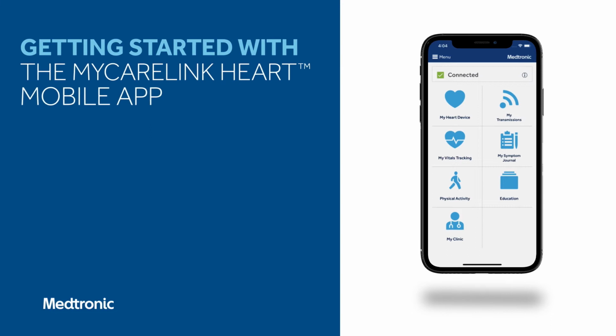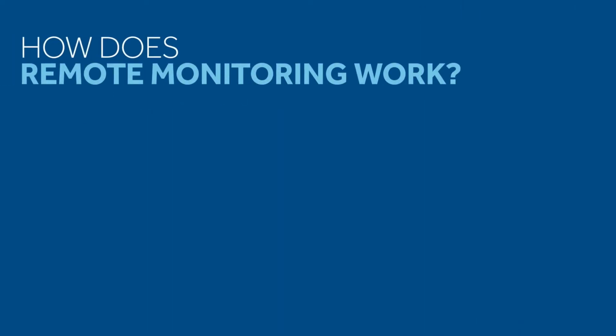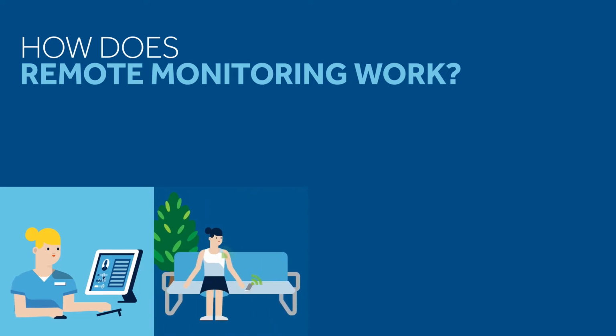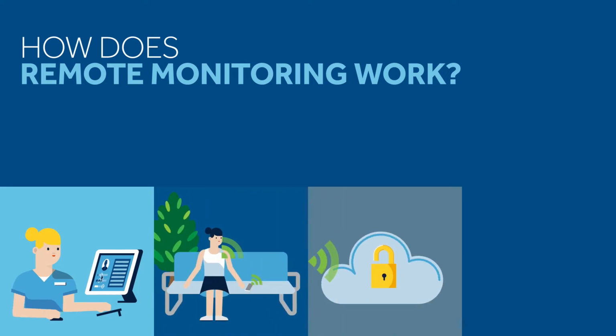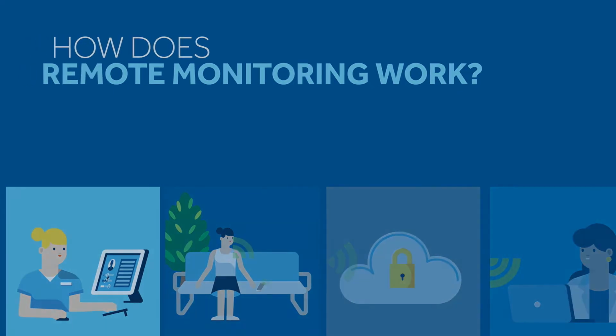Now that you have a heart device, it is important that you stay connected to your clinic with remote monitoring. Remote monitoring is prescribed by your doctor and lets you stay connected to your clinic via a secure Medtronic network. It is convenient and easy, allowing you to continue living your life feeling secure and connected.